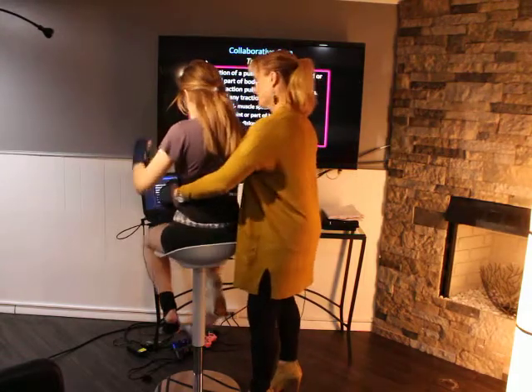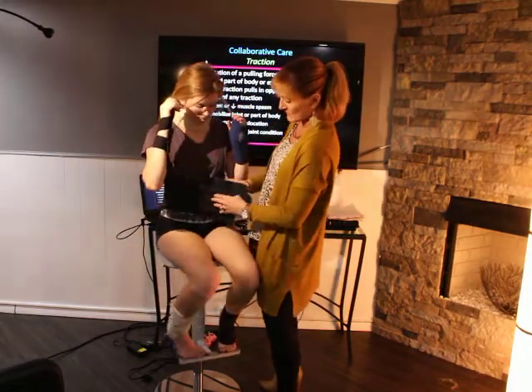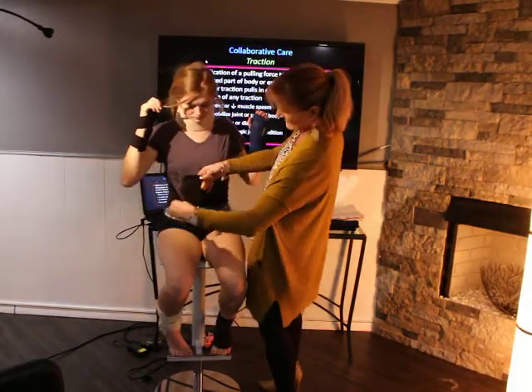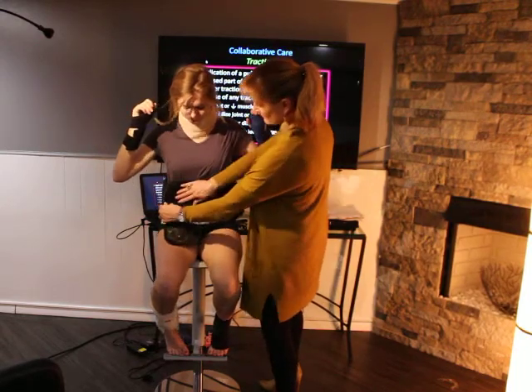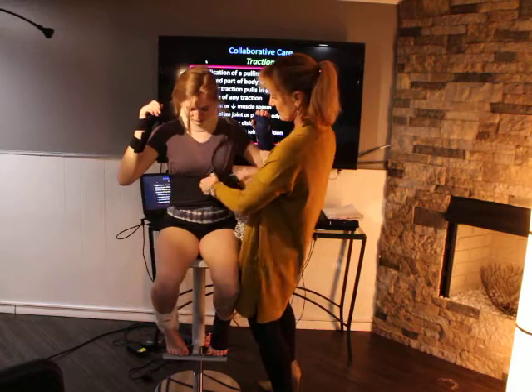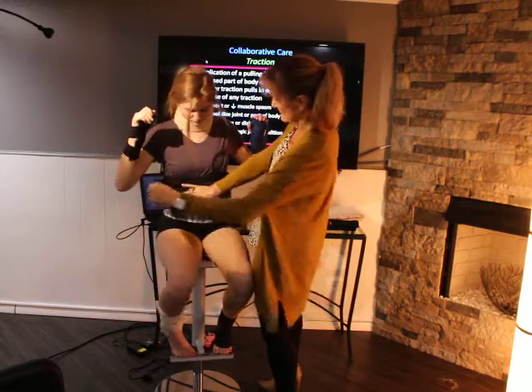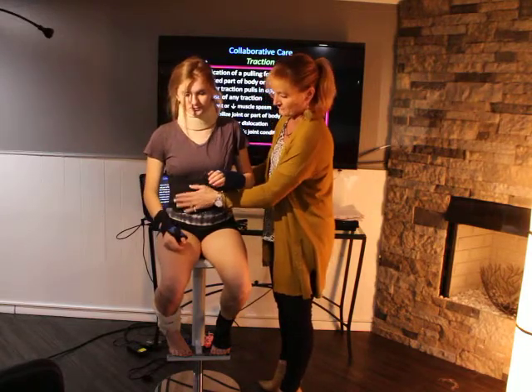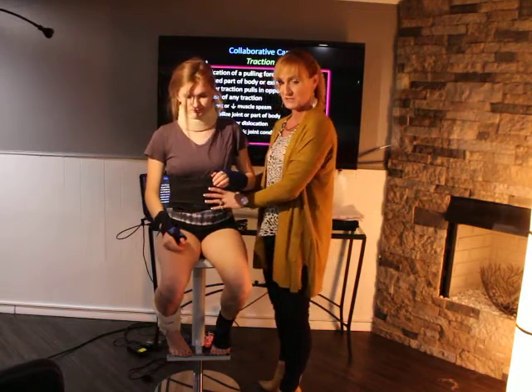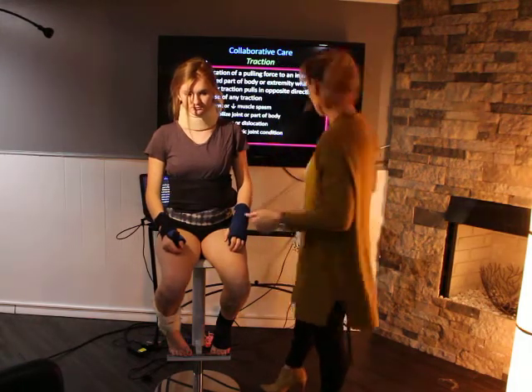And then you're gonna bring this around. You wrap it on your patient, and it's fully adjustable, however big your patient is. You just put the Velcro on, wrap this around on your patient. And that's going to offer both anterior and posterior support in your patients who have muscle strains in their back.